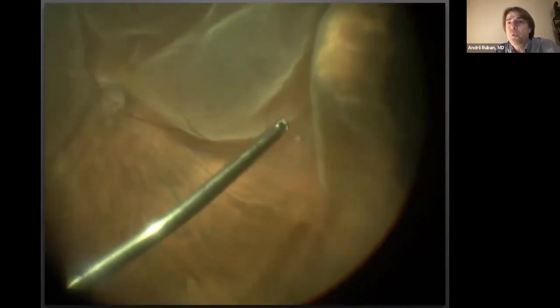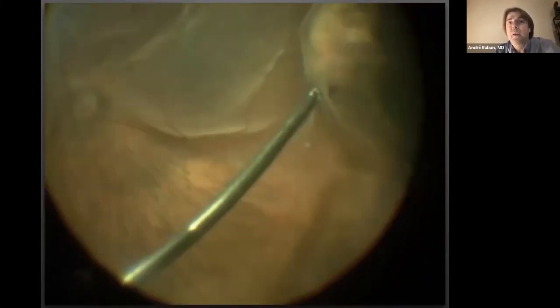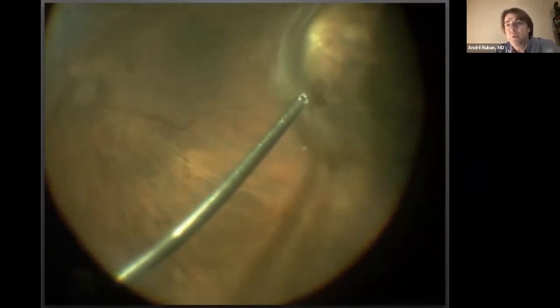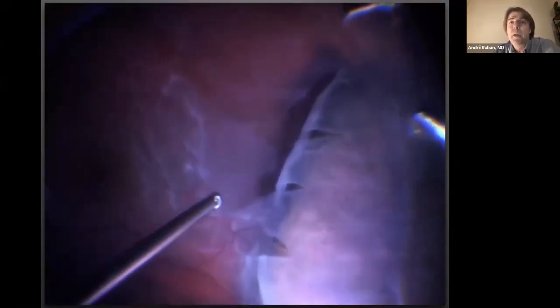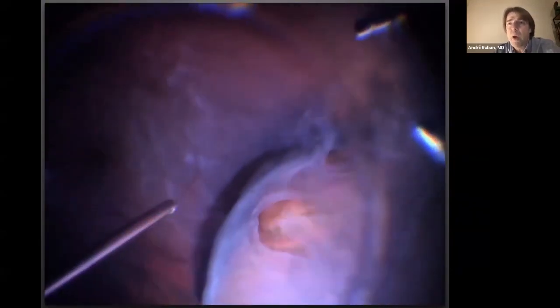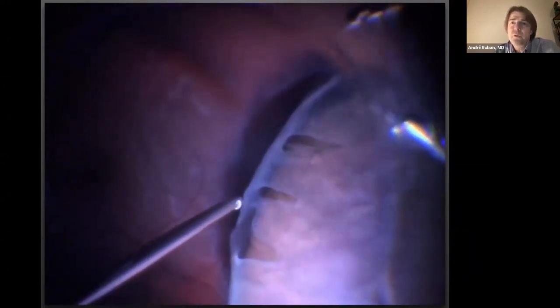It is essential to remove as much vitreous as possible without creating new retinal breaks. Scleral depression under wide angle visualization with additional illumination is very effective for this purpose. If the posterior hyaloid is detached, I prefer to start by manual vitrectomy from the periphery, as this approach reduces retinal traction and allows me to work on a more stable retina.